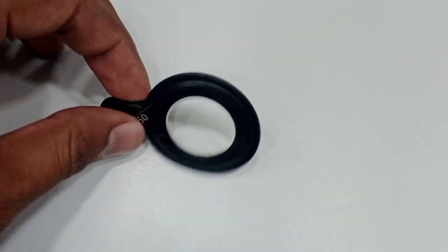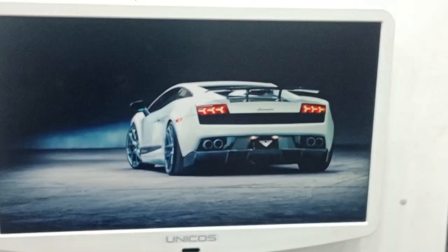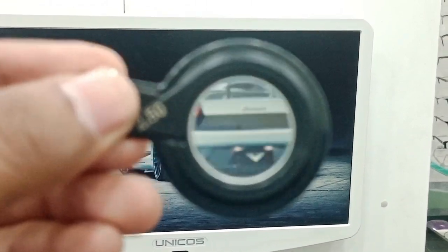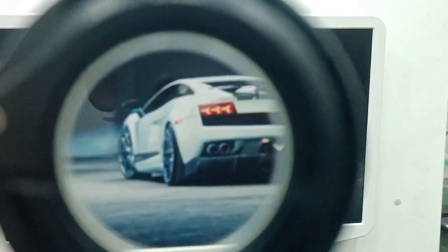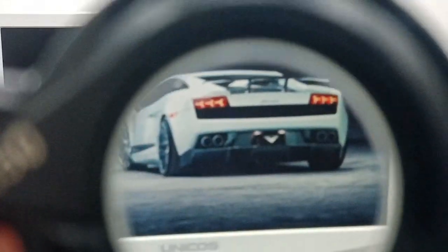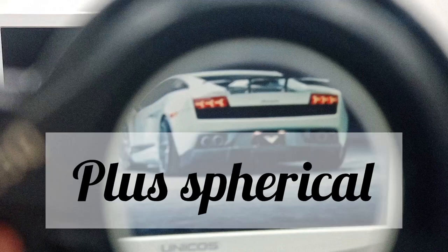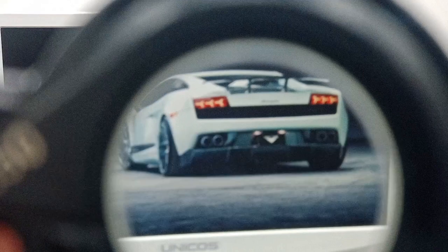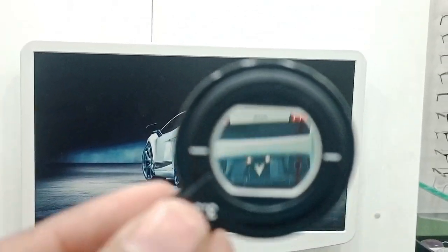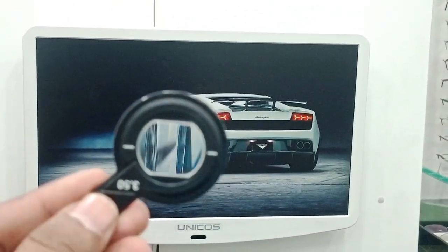Now I'll pick the plus spherical lens and see what happens. As I move the lens upward, the car moves downward — there is movement in the opposite direction between the lens and the object. So if there is opposite movement between the lens and the object, the lens is a plus spherical lens.